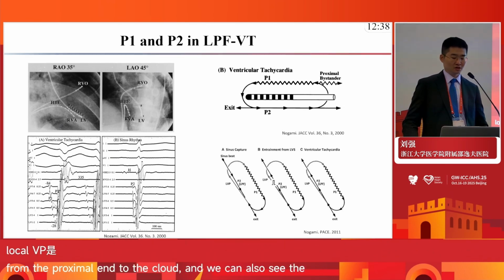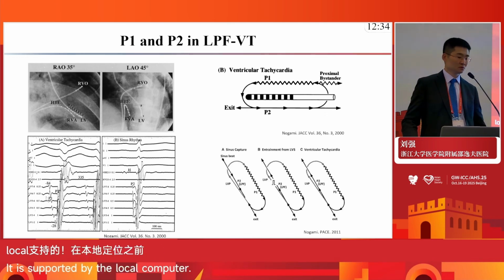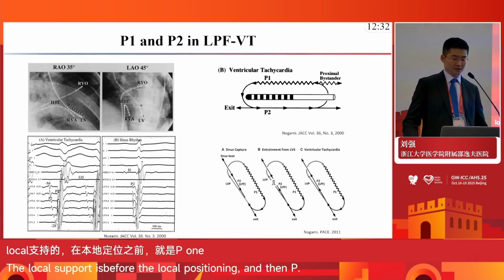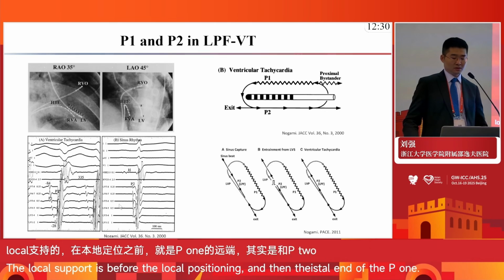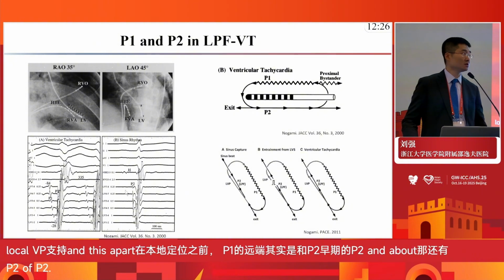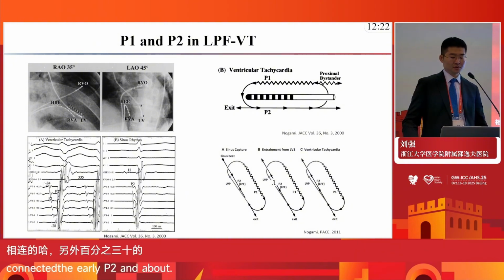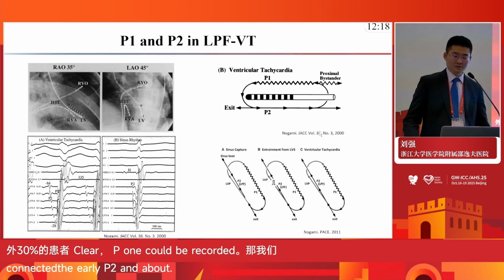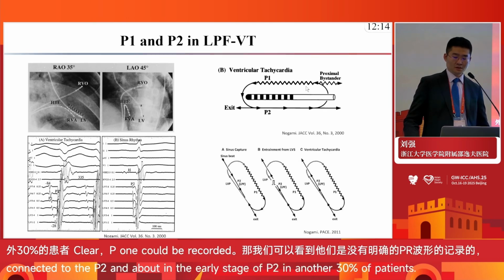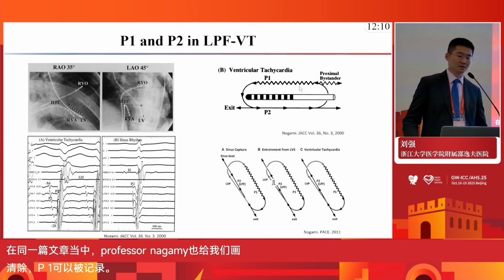The distal part of P1 connected with the earliest P2, so we say P1 activates P2. And in about 30% of patients in their group, no clear P1 could be recorded. In the same paper, Professor Nogami drew a diagram to explain the reentry circuit.